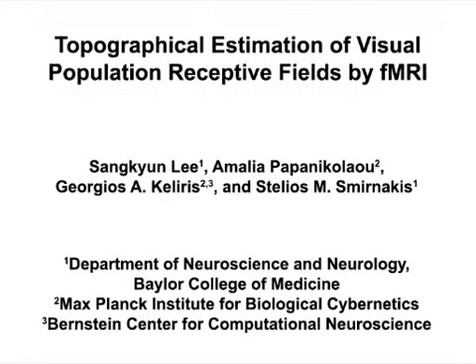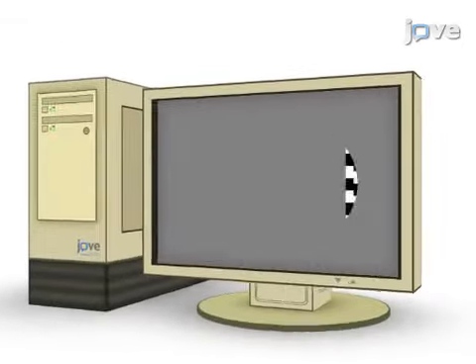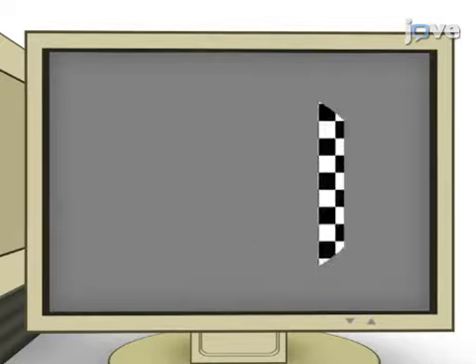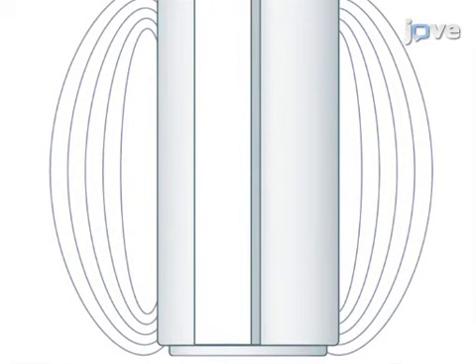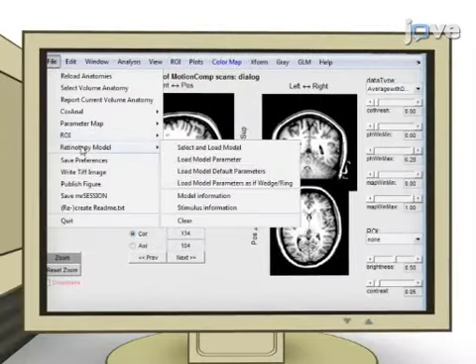The overall goal of this procedure is to estimate accurate visual population receptive fields. This is accomplished by first preparing effective and efficient visual stimuli localized in the visual space to elicit a distinct and robust response. The second step is to image functional brain activity with high visual attention and minimal movements of eye and head. The final step is to pre-process the acquired data.